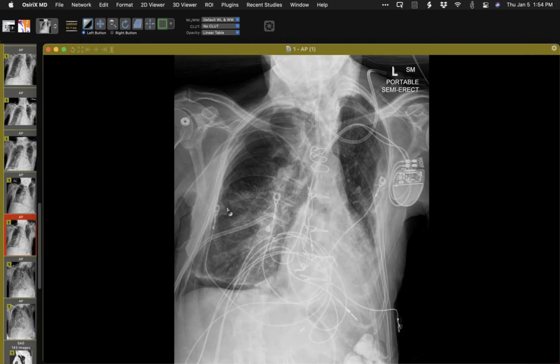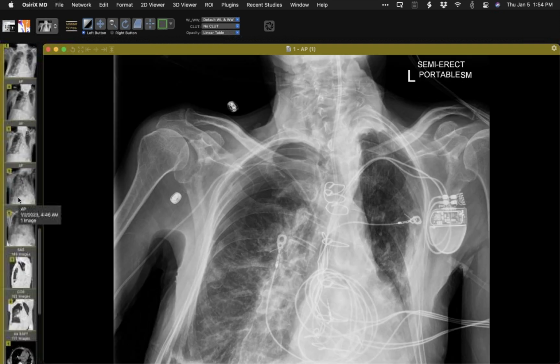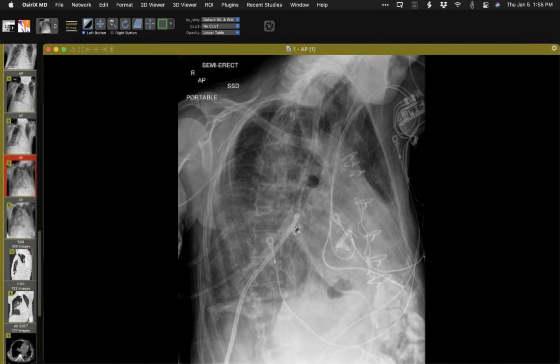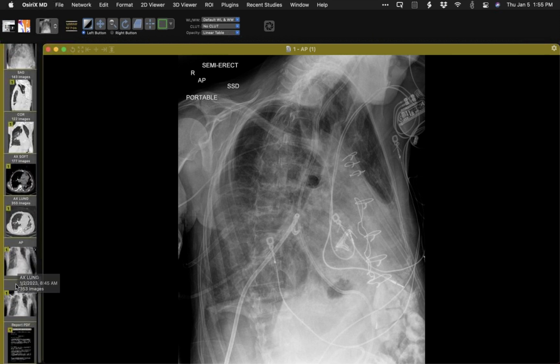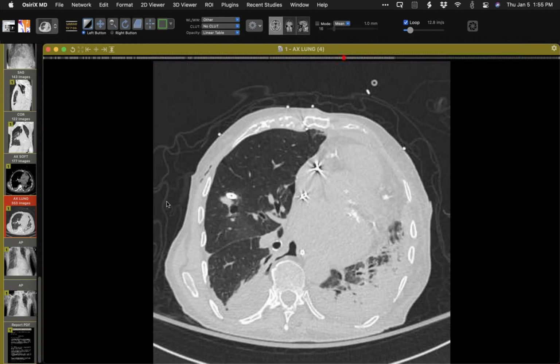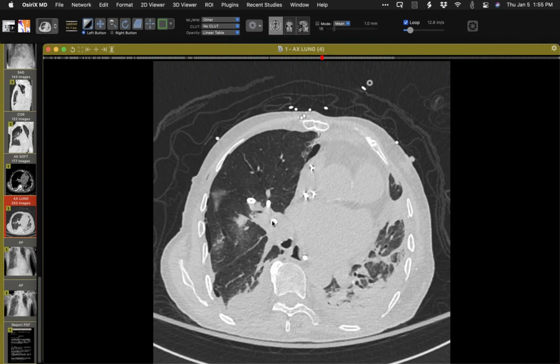I will show you that in spite of a catheter, and in fact 2 catheters, they still had trouble with that pneumothorax. And eventually he got a new catheter that looks like this, with persistent pneumothorax. So he had one catheter that was higher up that was taken out. And just prior to the CT, this catheter was placed. Here we go. Looking at the CT, evaluating the location of the catheter he has at the moment, you can see that it really just traverses the right middle lobe and ends up here.